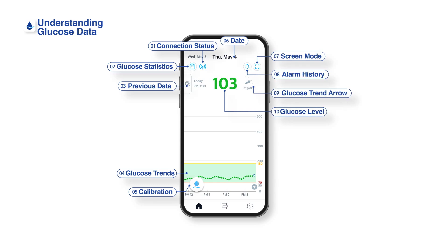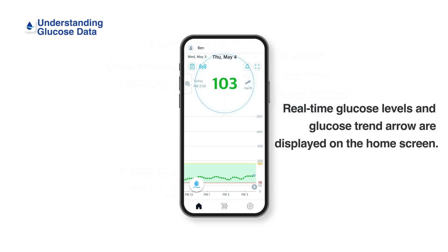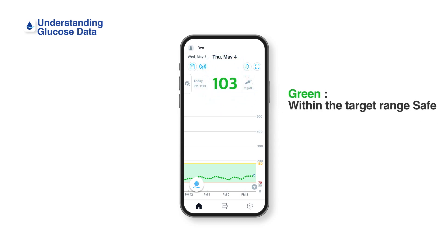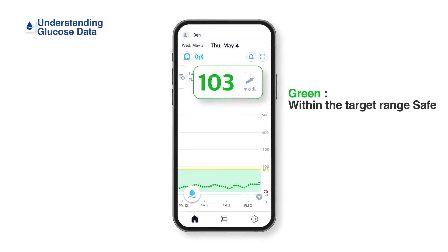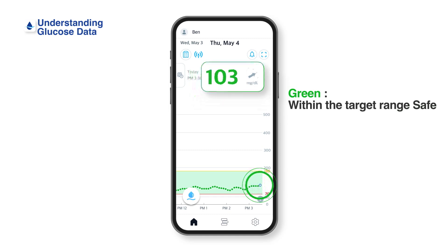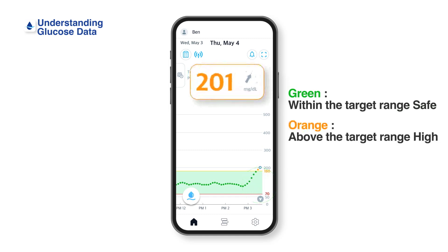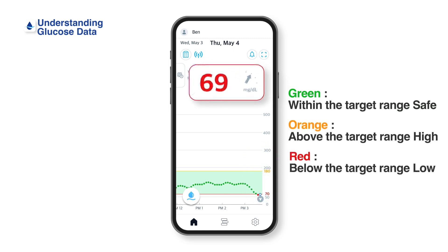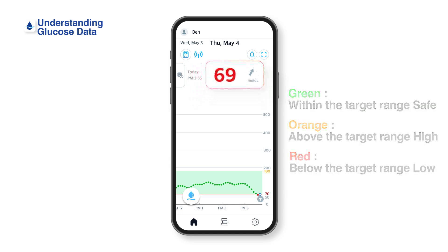In the Kerasens Air app, Instant Glucose Data and Glucose Trend Arrow are displayed on the home screen. Your dynamic glucose data will appear in different colors depending on where it is in your target glucose range: green if it is within range, orange if it is high, and red if it is low.